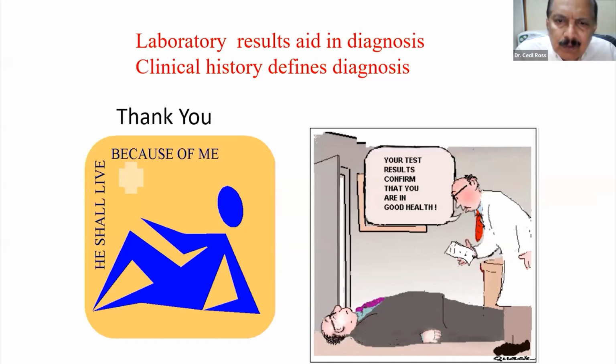So you have to ask your laboratory how the controls are made. Manufactured control is very costly, so laboratories have a control and an internal quality assurance. They are accredited to the World Federation or some EQAS program, and they have a value that they constantly keep checking. Manufactured control or population control, your laboratory will decide.